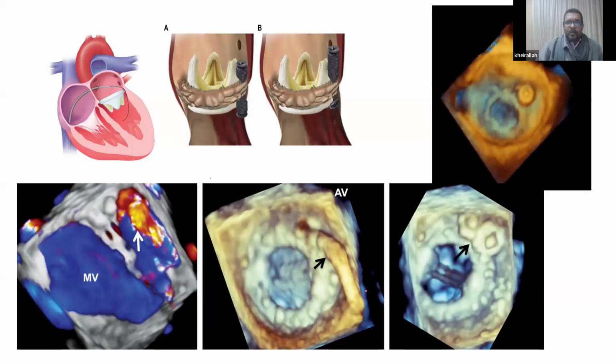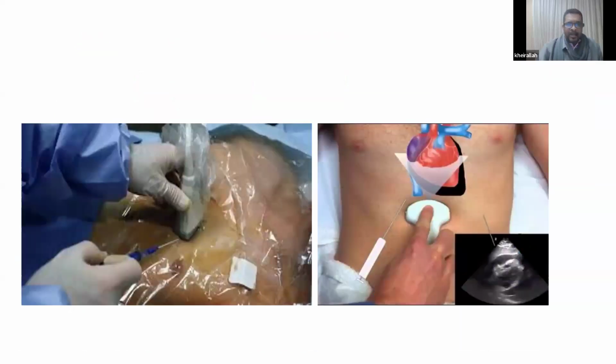So you are going to tell them exactly, like in here, this is the catheter guided towards the hole and where they have to go and how they put their plug, and if the plug seals enough, if there is residual leak, is it encroaching upon the valve disc, or all of that, that's done by TEE guidance.